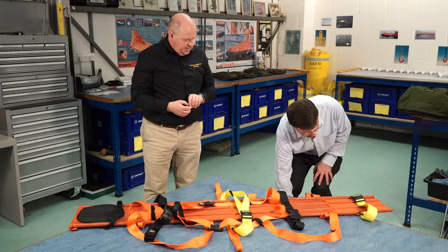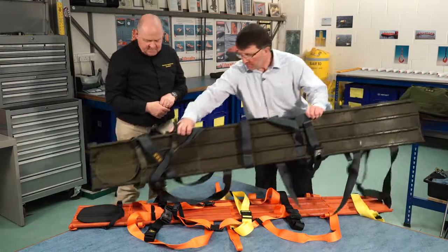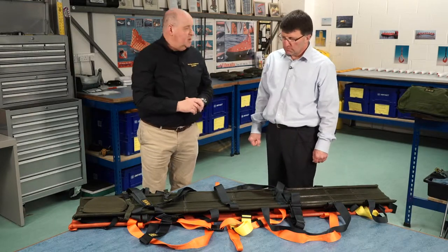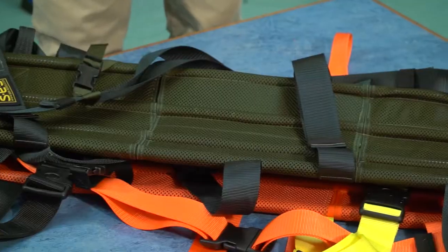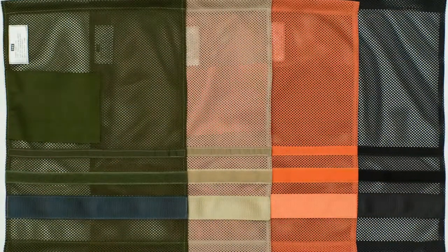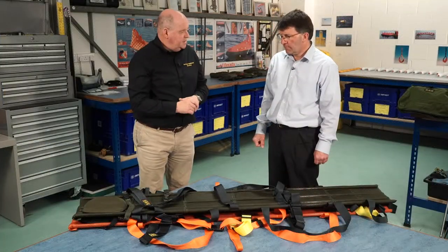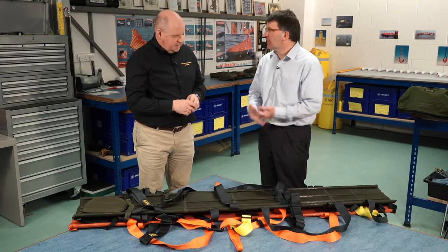Down here we've got an identical stretcher but in a completely different colour — so tell me why have you got different colours? The orange one is primarily our commercial product, for rescue services — fire, ambulance, those sort of people. But the green we've aimed at the military market. So we have green, we have a sand, and we have a complete black for so-called covert operations. And they're built to the same standard, so you've got basically a stretcher for any environment, any use.